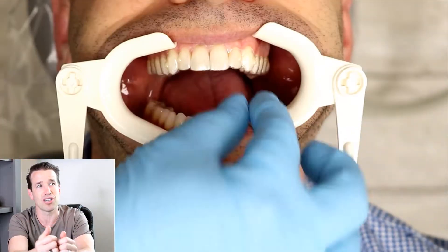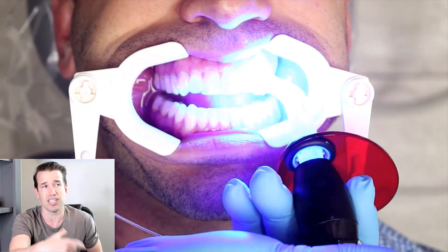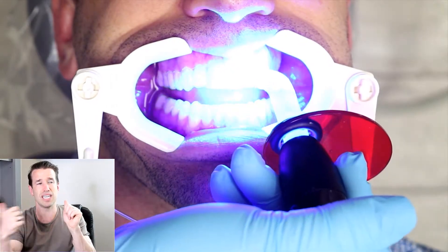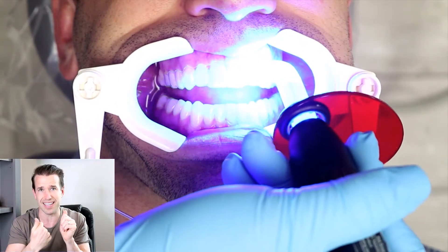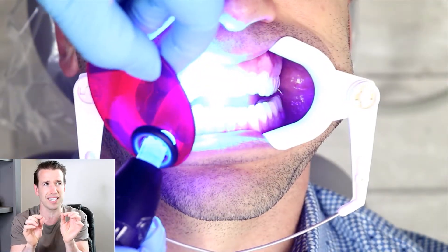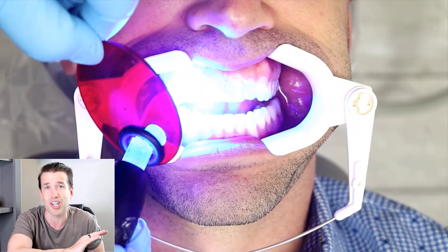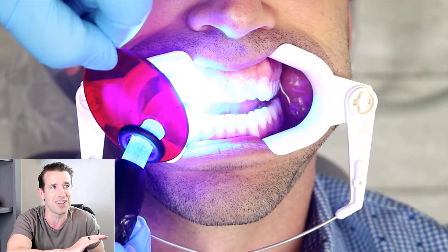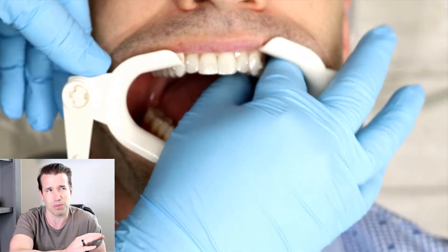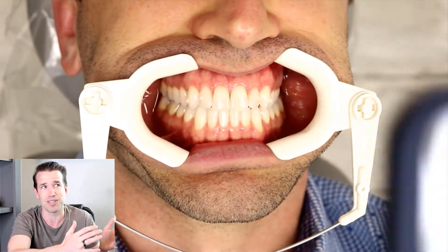She has the composite or the glue already in these trays — the trays that I'm basically going to put on — and now she's curing it. So she puts the glue in the tray, puts the tray in, it fits really nice, and then you glue those attachments on the teeth. That is how we get those attachments in that very specific place so that when you put in your trays, it actually fits. She's doing a great job of curing all the teeth, making sure everything is nice and on there really well. We cure for roughly five seconds per tooth because we have a high-powered curing light.